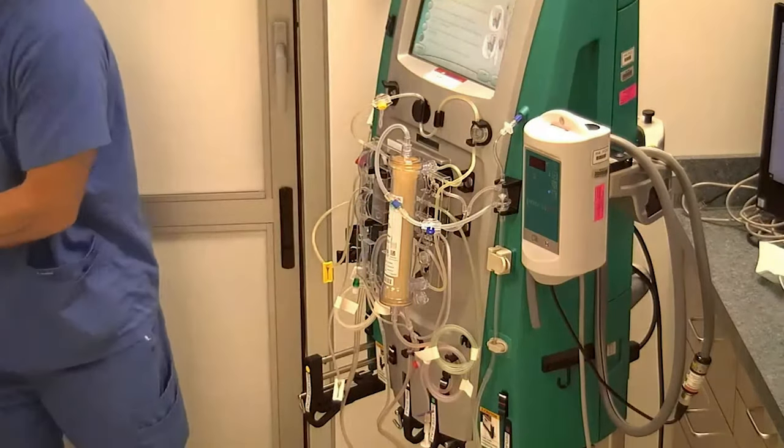All right, as we can see here on this message on the screen, it says that we have passed our prime test. So from here, we can now adjust our chamber. The deaeration chamber is a very important piece of the machine. It should actually be checked at least once an hour. It's kind of hard to see here, but you can feel it, I'm kind of scratching at it. There's a frosty line right here, and right now it's fluid, but while the treatment is going on, it's blood level. We want to keep that level right at that frosty line.